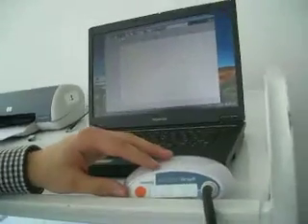Now that was the end of the first phase. Now the blood pressure values are obtained, and according to the obtained values, two different pressure steps will be performed now. The first is the so-called diastolic pressure level. So this is one phase where some of the arterial function parameters are obtained from, and now this is one of the most important steps, if not the most important.